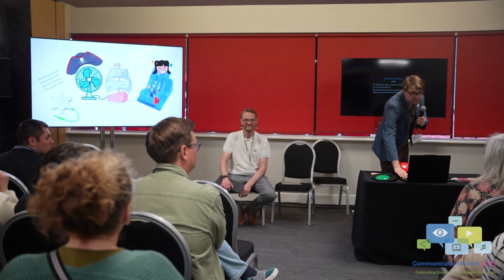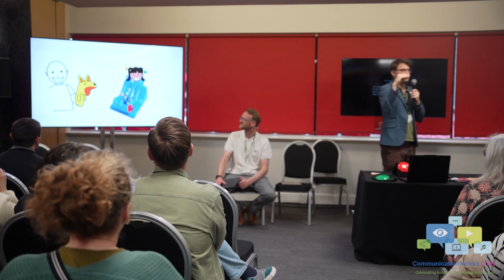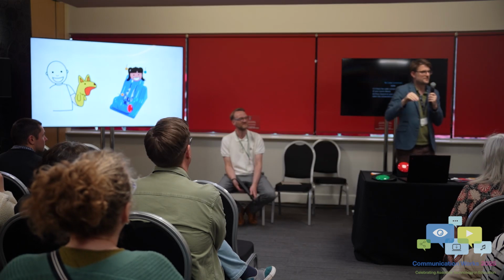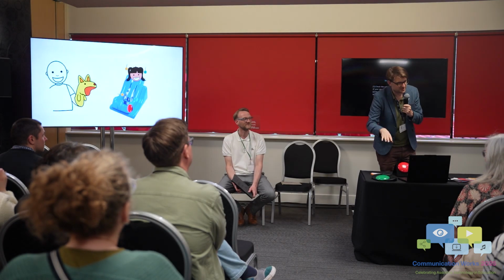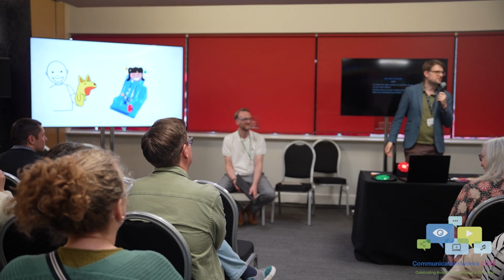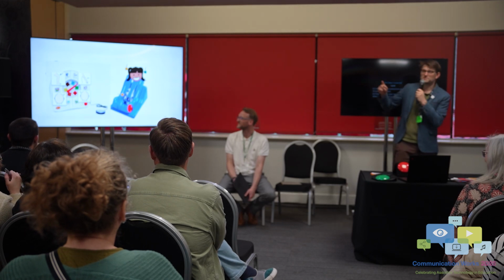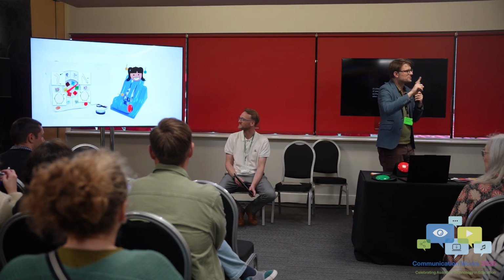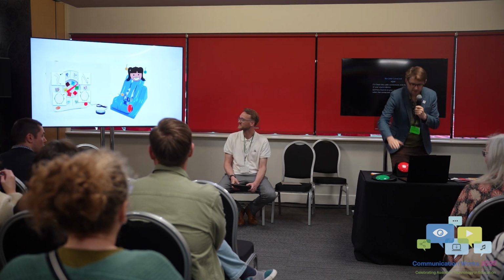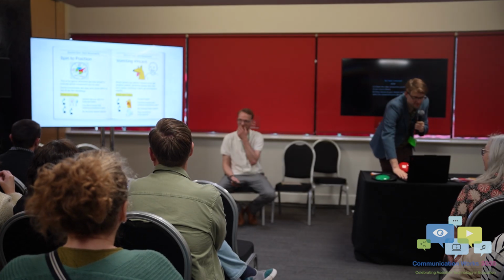Another little activity is this vomiting puppet thing, and basically it eats up switches, or pretends to, and then it vomits, also pretending, the switch back up in a different position, and the young person has to find where the switch has been vomited. Then there's another one where they press a spinner, and it spins round and points to a different body part, and then the young person has to move that body part to find the switch. These appear in the book as well, and here's a little video of the second one.